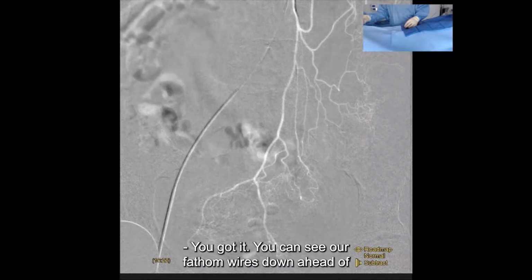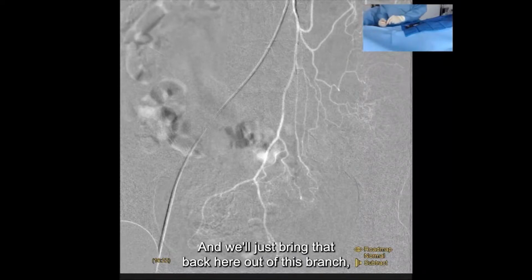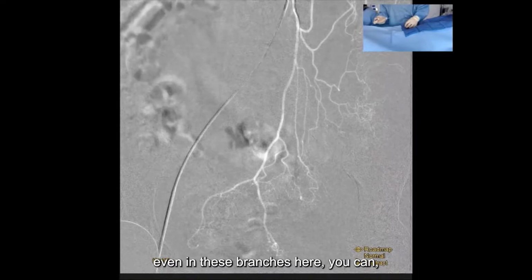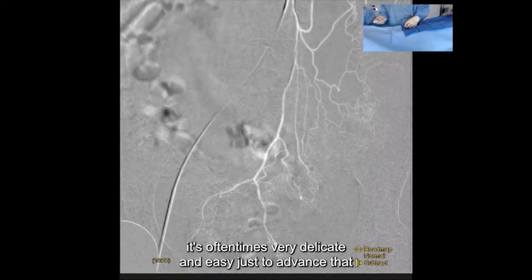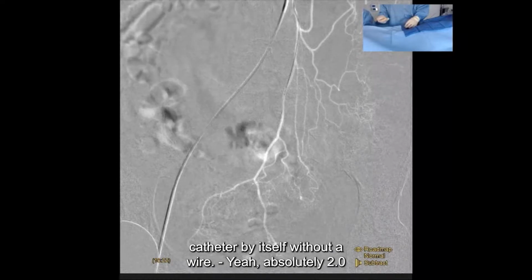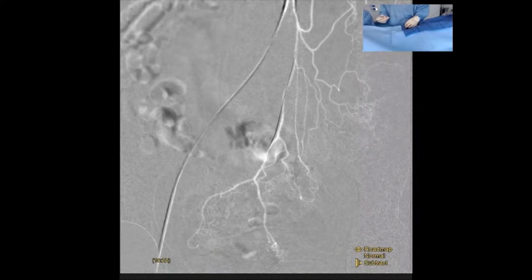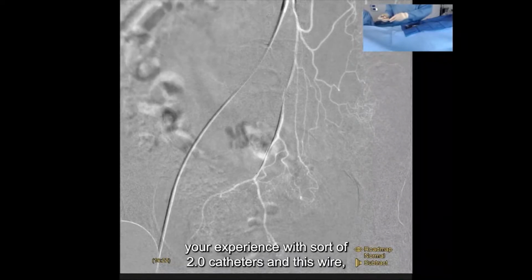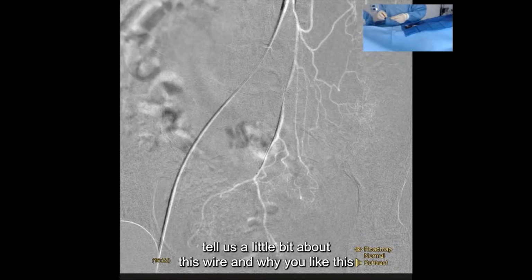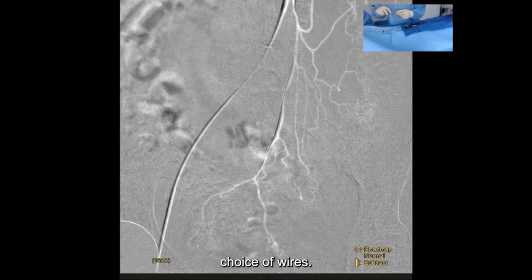You got it. You can see our Fathom wire is down ahead of our TruSelect, and we'll just bring that back out of this branch. What's nice about this catheter too is, even in these branches, it's oftentimes very delicate and easy just to advance that catheter by itself without a wire. Yeah, absolutely. That can be really nice. Sure is. So, your experience with 2.0 catheters and this wire, tell us a little bit about this wire and why you like this one. Yeah, Fathom tends to be my first choice of wires.